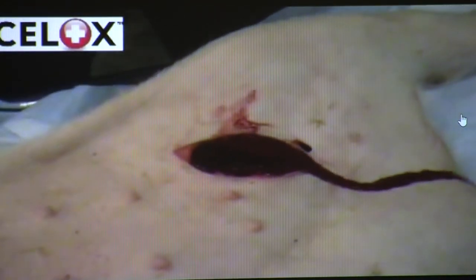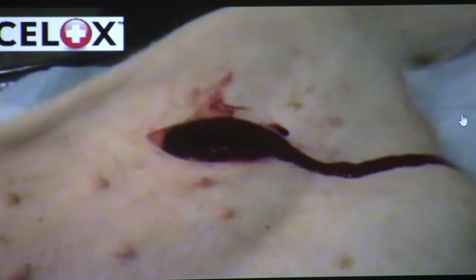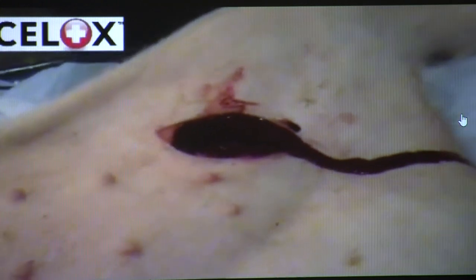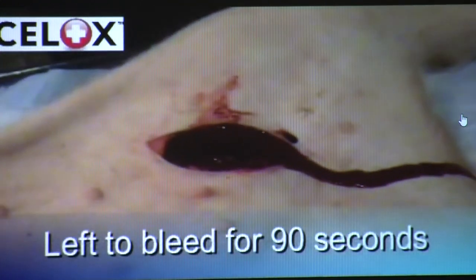No bacon was harmed in the making of this. This allows blood pressure to drop. However, to make it more challenging, Celox is used after only 90 seconds.